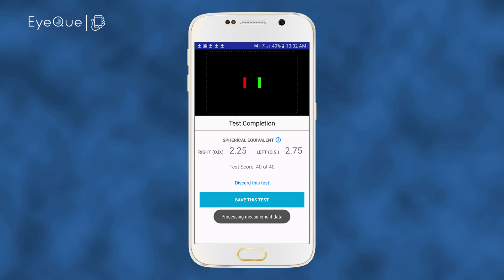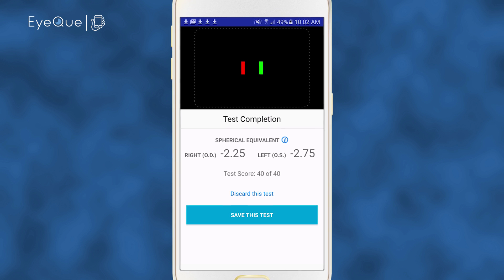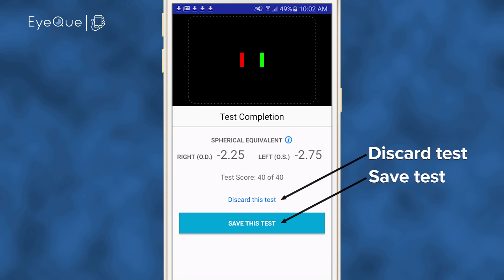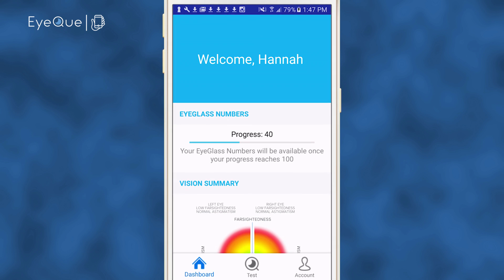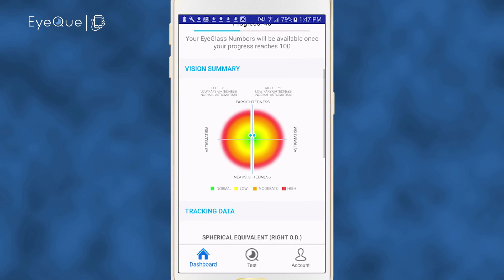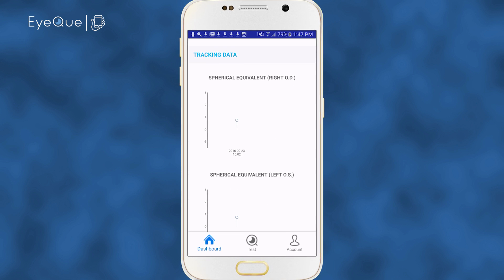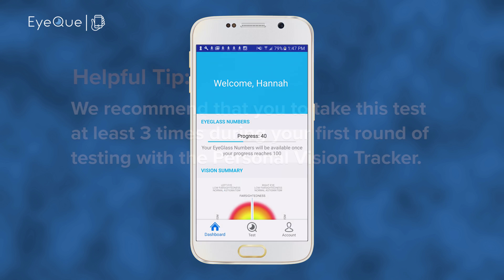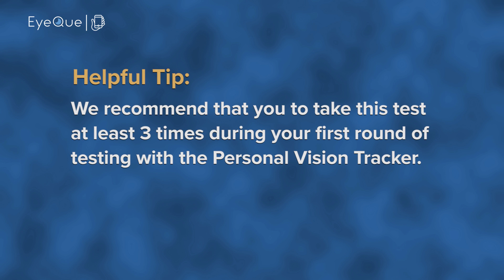Now the test completion screen appears with the first indication of your vision. There's also a test score which shows how well you performed on the test. You can discard the test or click Save this test. You'll return automatically to the dashboard where your initial test results and progress score will be displayed. We recommend that you take this test at least three times during your first round of testing with the Personal Vision Tracker.